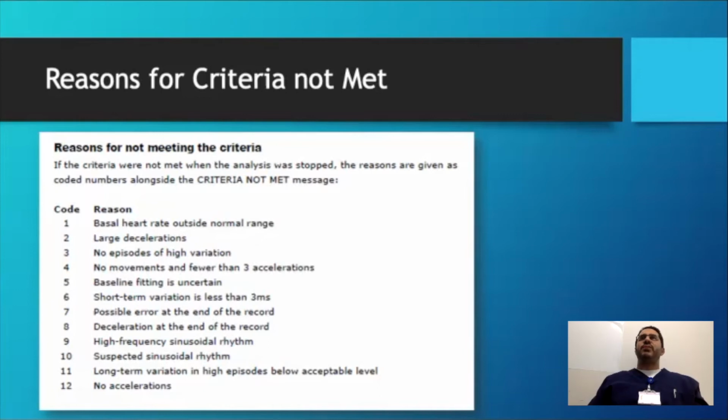But the baby where I'm coming for daily CTG assessments or twice a day CTG assessments, I am worried because this baby's IUGR and I'm trying to time when I'm going to be delivering that baby, because every 6 hours actually counts for this baby. I definitely need the entire 60 minutes, I need the full assessment. And to put that into my own clinical context of the things where Dawes-Redman does not help. Does that make sense?